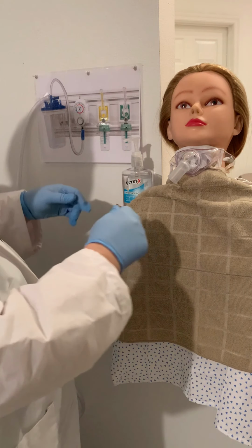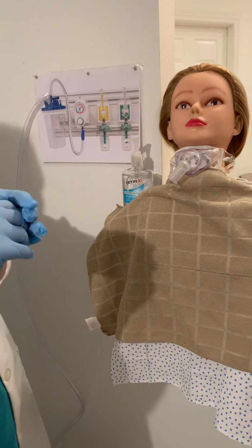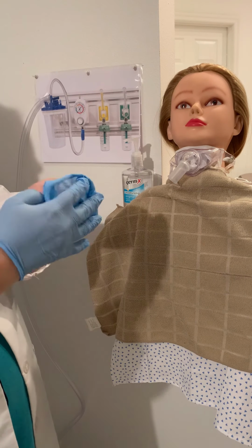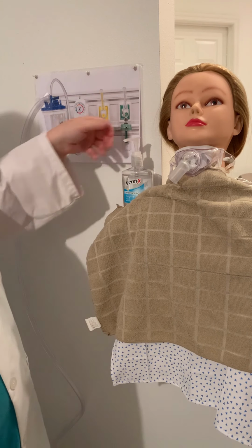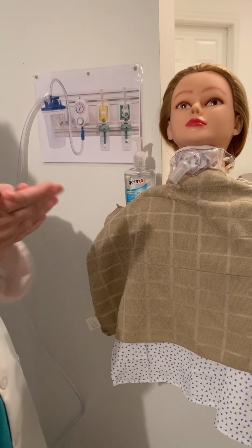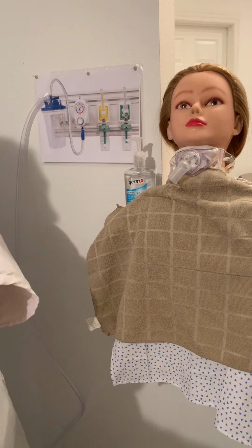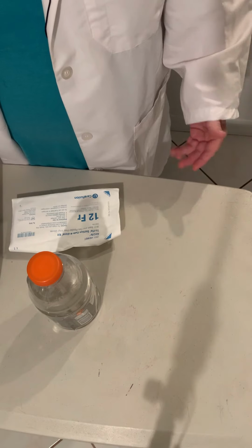Okay. So now we're ready to open our suction kit. So we're going to go ahead and take off these gloves, discard those, and wash our hands again. We are going to get everything ready. So we're going to want to adjust our table.